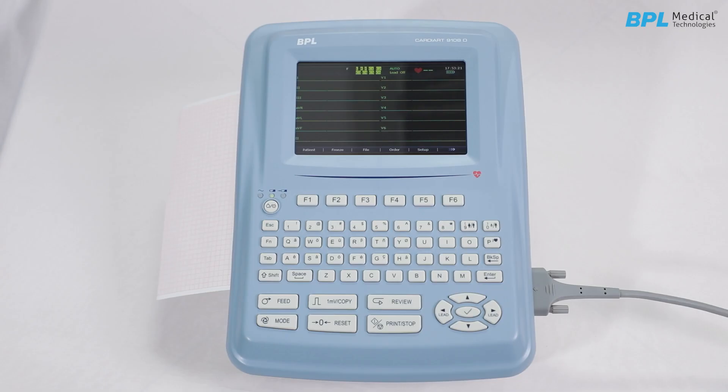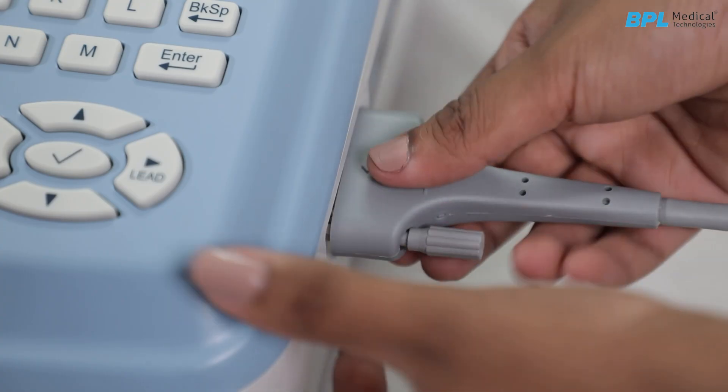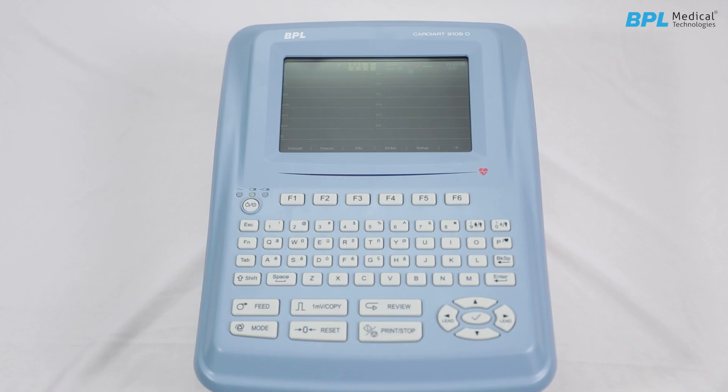To turn off the machine, long press the power on/off button. After turning off, carefully disconnect the ECG cable, untangle the wires, and clean the gel from the electrodes.